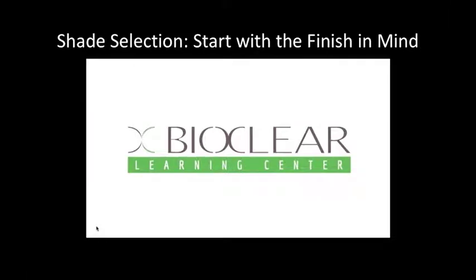I know that with a lot of clinicians, what we've always done is take a little swatch of composite, place it on the tooth, patty cake it a little bit with an instrument, and then cure it. Then we look at that and decide if it looks like an appropriate shade or not. And probably the biggest worry that people have had is whether or not the teeth are dehydrated, because that's going to influence our color selection.